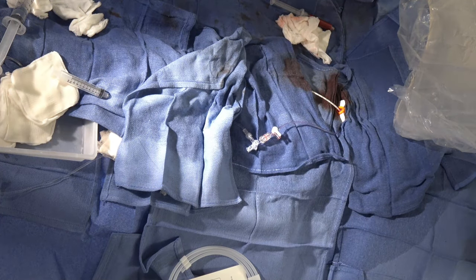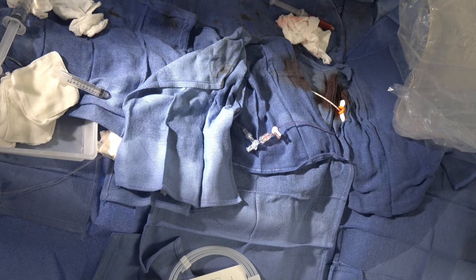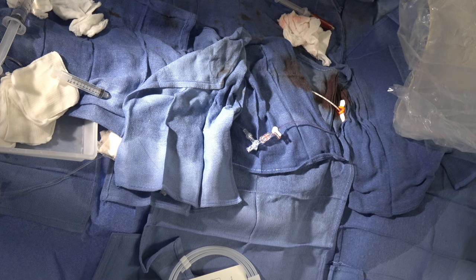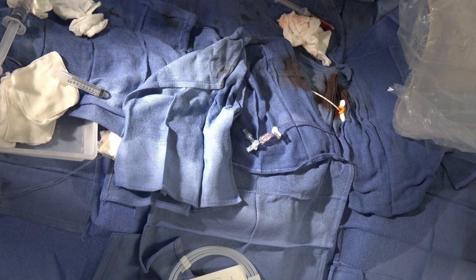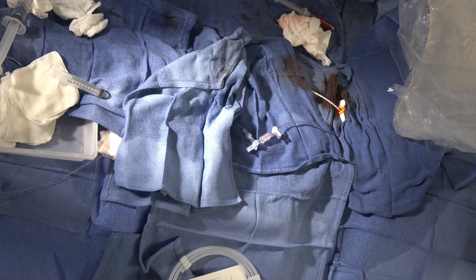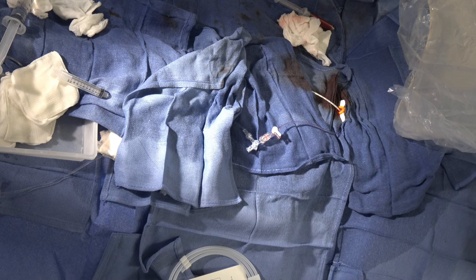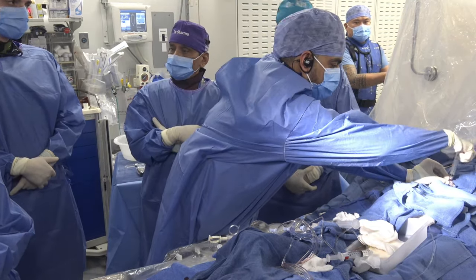Closure is so important. Dr. Kaki mentioned he always uses contralateral access to take a completion angiography picture. We don't always do that for all PCIs — for shock patients we like completion angiography at the end. Sometimes we just put a microcatheter back in and take a picture. Dr. Kaki and Ted Shriver have not adopted single access — they're committed to the completion angiogram. Their vascular access complication rate with up-and-over tamponade as a bail-out is so low with this approach.